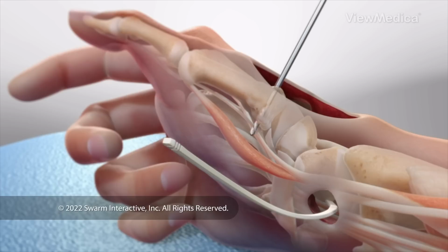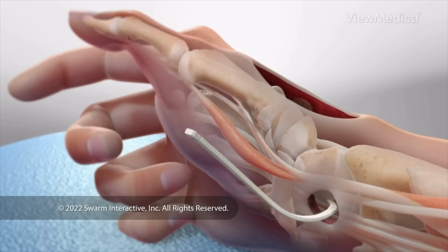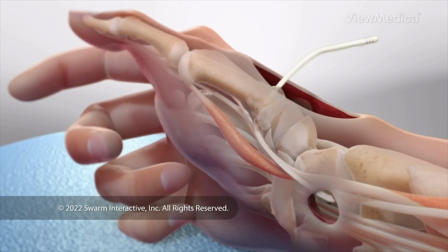Now we drill a tunnel through the base of your thumb's metacarpal. We pass the tendon through this tunnel and anchor it securely. This leaves a length of slack in the tendon.